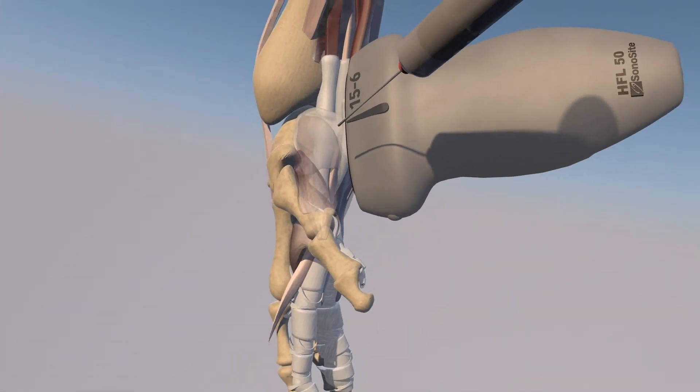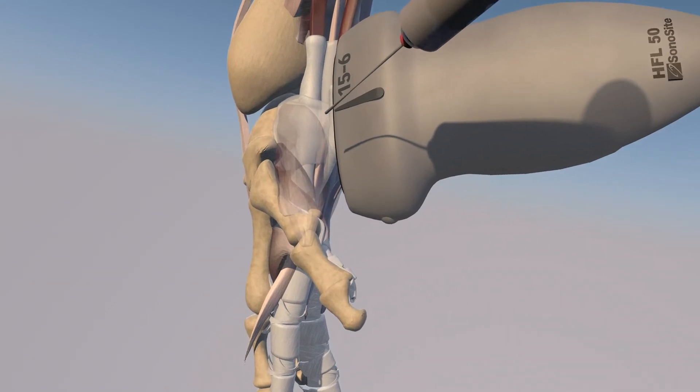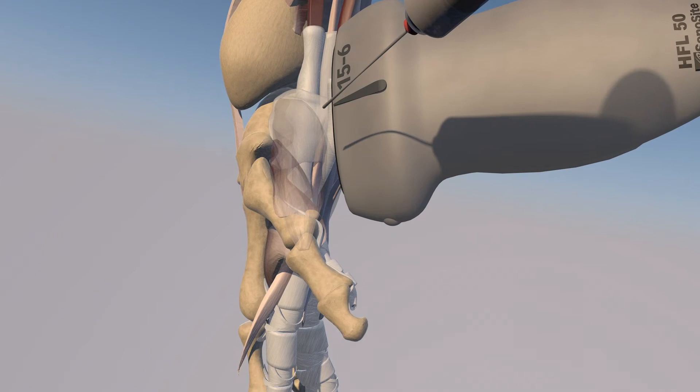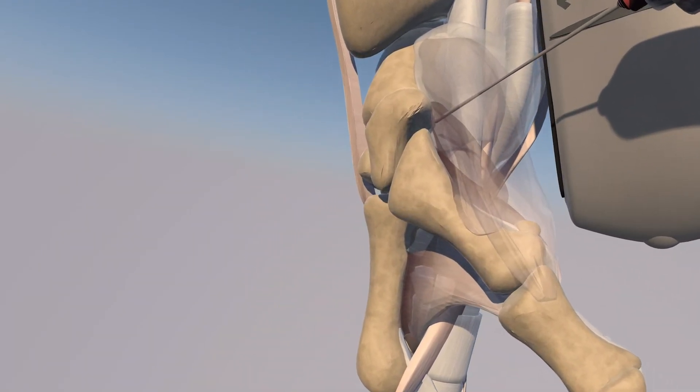This is going to be an out-of-plane approach injection, where you will only see the needle tip, or perhaps just some tissue movement using the jiggle technique. We're going right above the CMC joint with the needle and then injecting into that recess right above the joint.